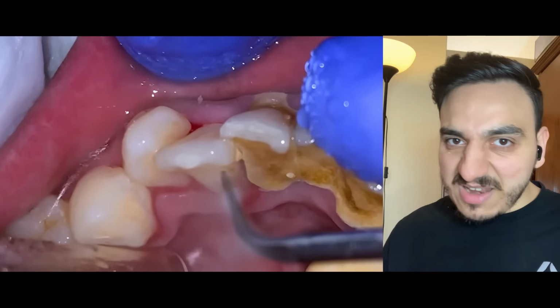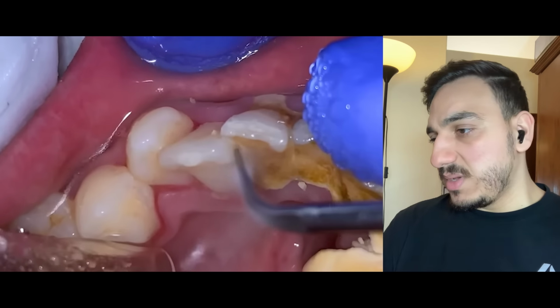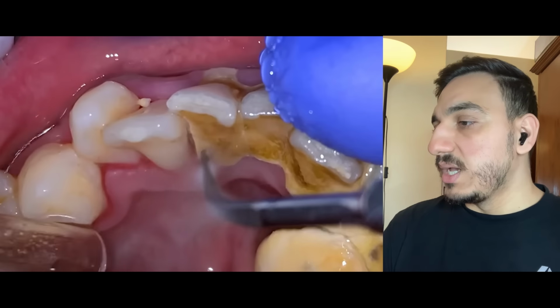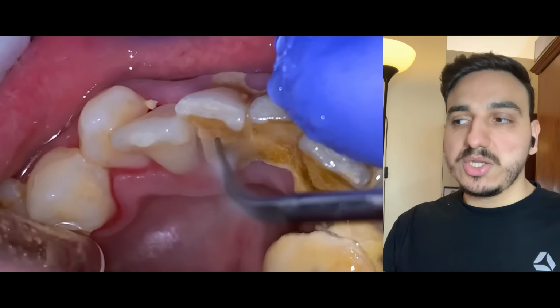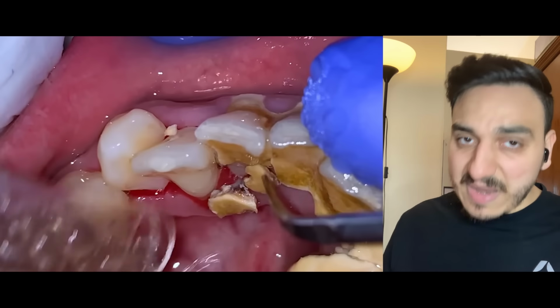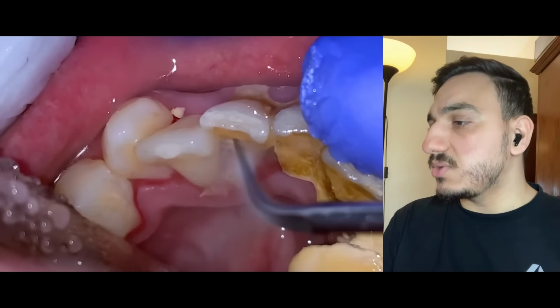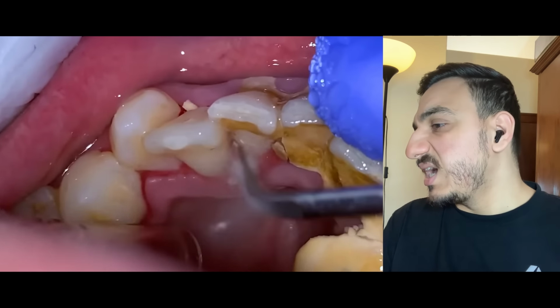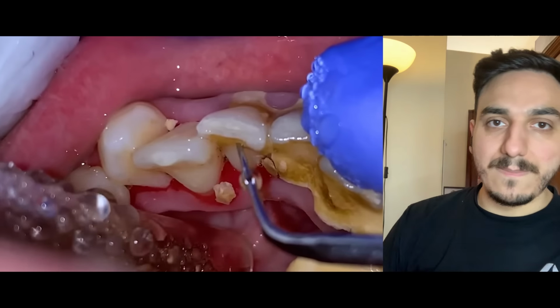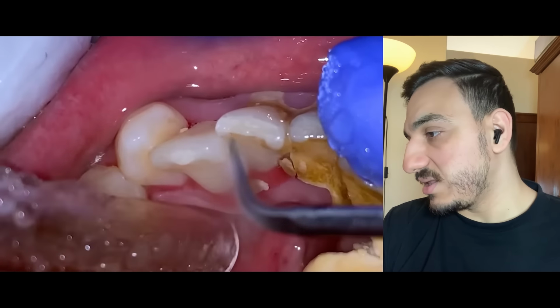But of course, with experience... oh, look at all of these gums. They're pretty inflamed, a really bad situation. Most probably gum disease is there. Some of the major contributing factors to gum disease are things like dental plaque, also dental tartar plays a role, dental calculus, and so forth. Some of that dental tartar is also covering really extensive surface areas of the teeth.